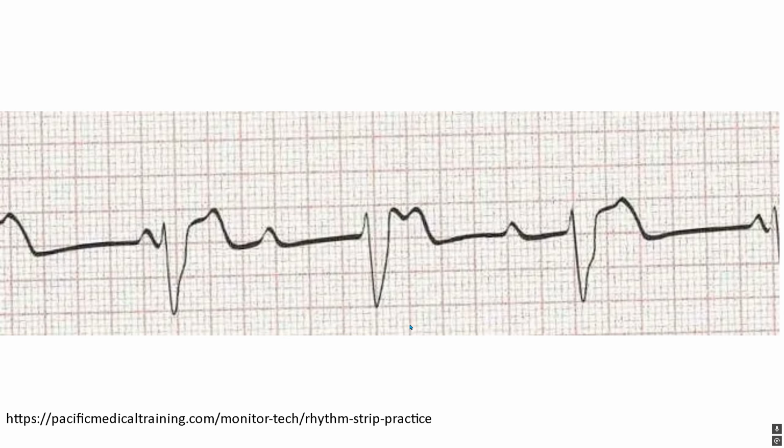Now, like we talked about, let's go through this and see what our rhythm is, okay? P, QRST, P, QRST, P, QRST. Look at it, there's a P without a QRS, correct? Now, let's see our P to P interval doesn't change at all, okay? Now, when we look at our PR interval, it's all over the place.